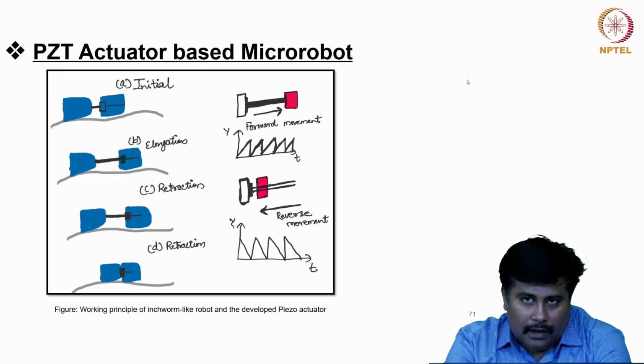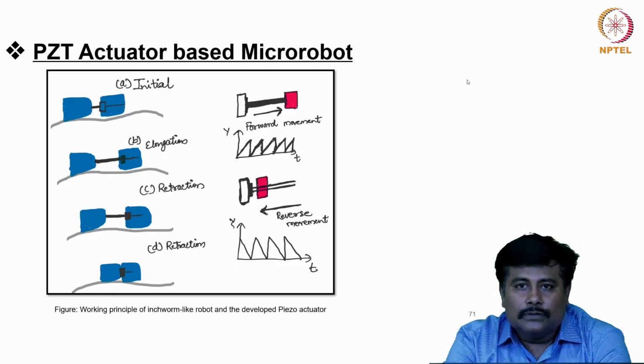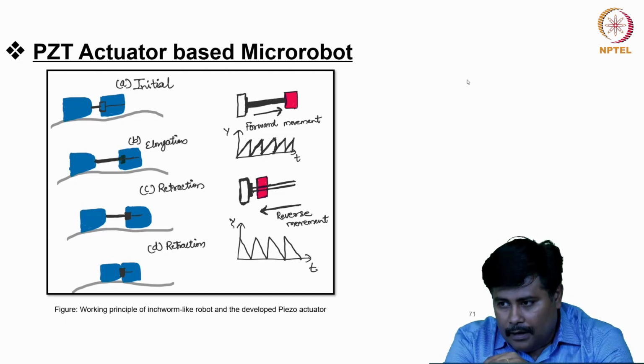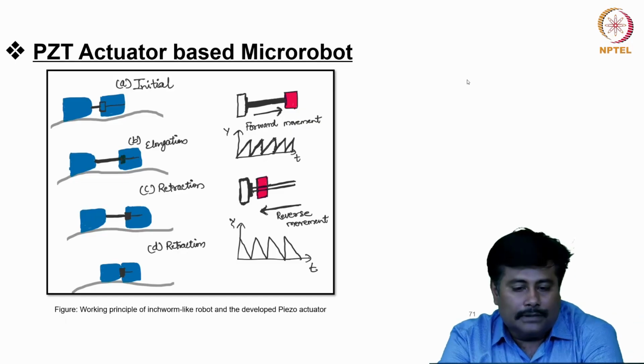In this particular mechanism, when we use it for endoscopy related applications, two sets of movements are experienced using these PZT based actuators.